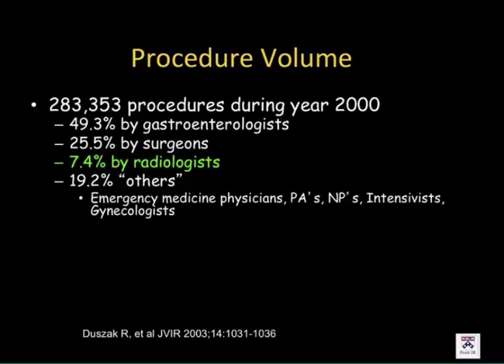And surgeons, and by the way, when we mention surgeons, most of the time they do the same PEG tube as a gastroenterologist. Almost nobody does open surgical. There's some literature out there about laparoscopic placement, but whatever I understand from my surgeons, it's very rudimentary and performed only in a few hospitals.